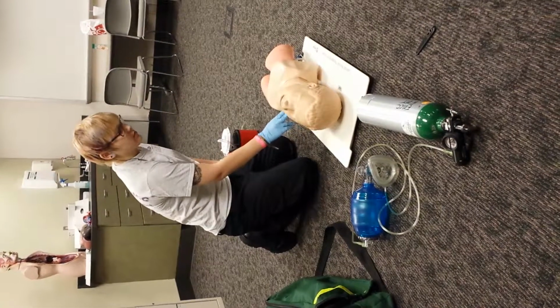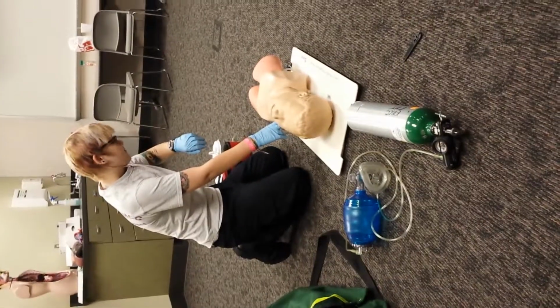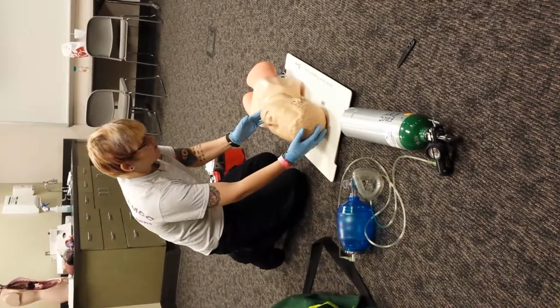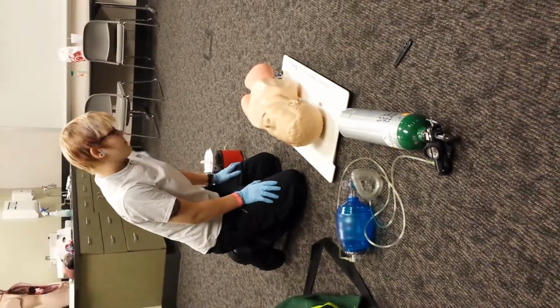I'm going to check his carotid pulse for 5 to 10 seconds. You palpate a weak carotid pulse at a rate of 60. I'm going to do a head tilt chin lift. The mouth is full of secretions and vomitus.